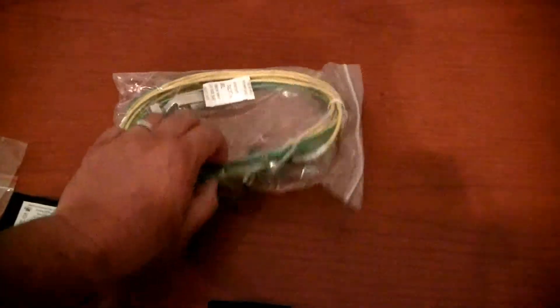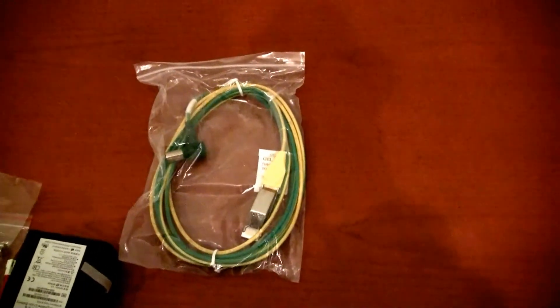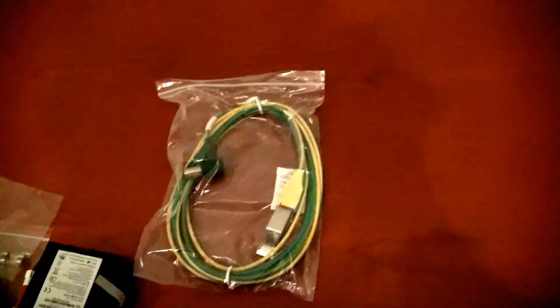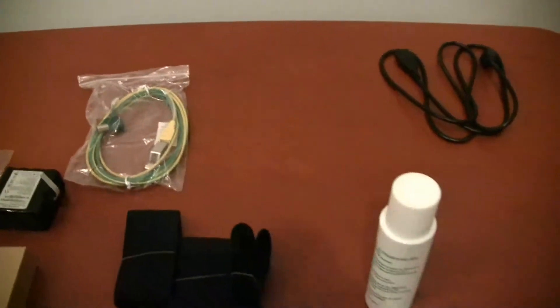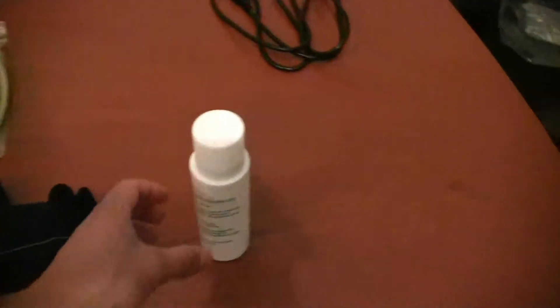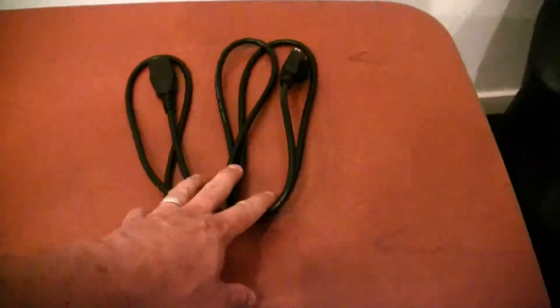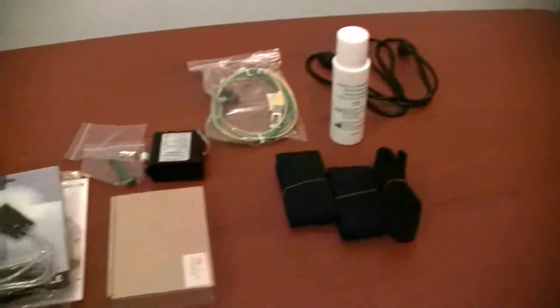A ground cable is included, which typically doesn't apply in the United States, but if the unit is going overseas with a non-grounded electrical system it would come into play. It can also be used in the States if you're getting any interference from other devices in the room. It comes with a bottle of gel to use underneath the probes, and of course a US hospital grade power cable.